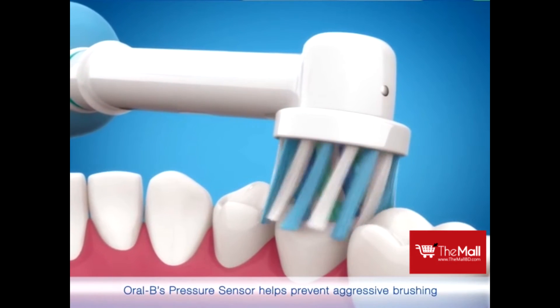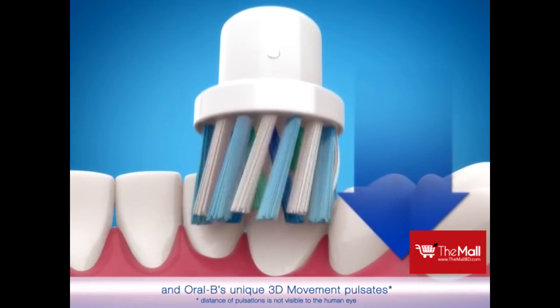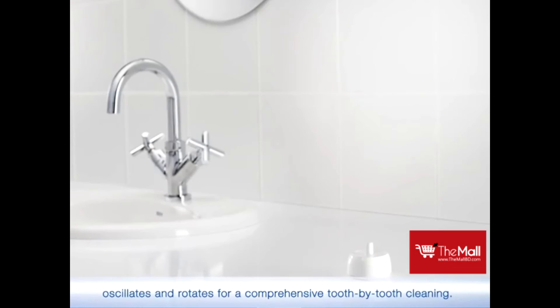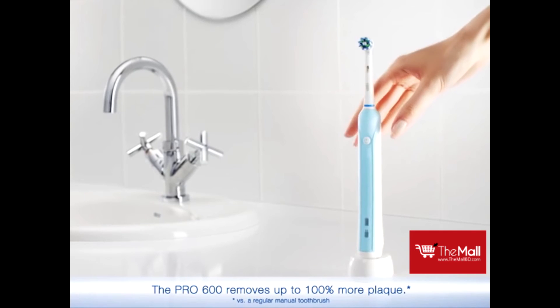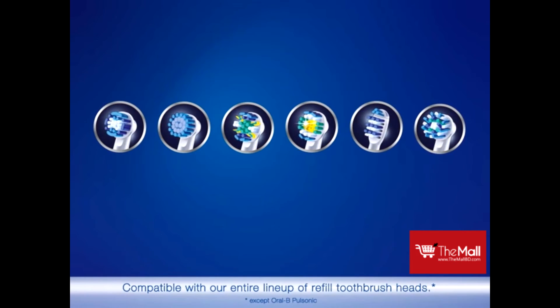Oral-B's pressure sensor helps prevent aggressive brushing. And Oral-B's unique 3D movement pulsates, oscillates and rotates for a comprehensive tooth by tooth cleaning. The Pro 600 removes up to 100% more plaque. Compatible with our entire line-up of refill toothbrush heads.